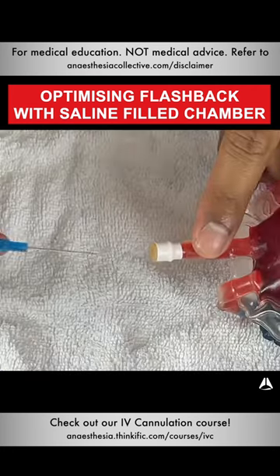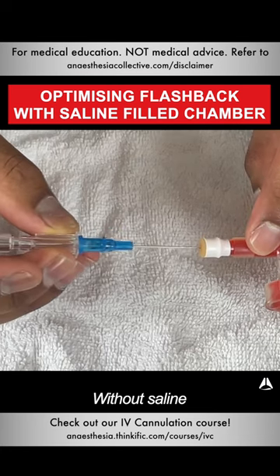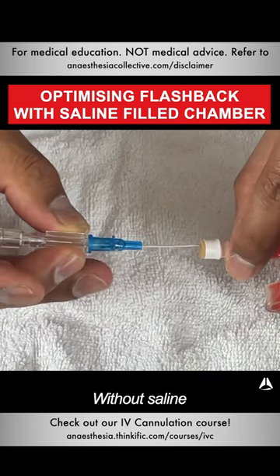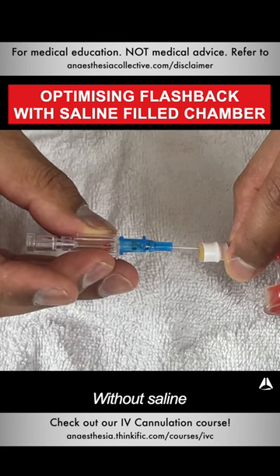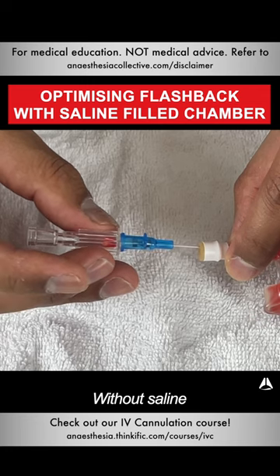I'm going to imitate puncturing through the vein and let's see how quickly it happens. So puncturing the vein — it's through there now — and then you'll see that a flashback has occurred in the chamber.